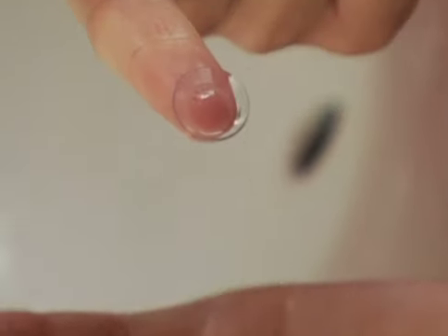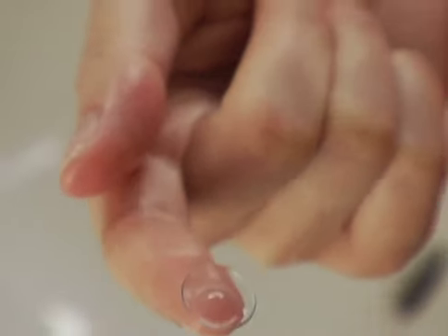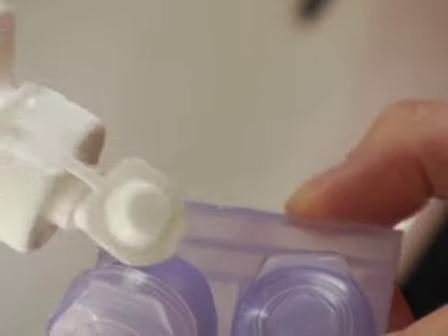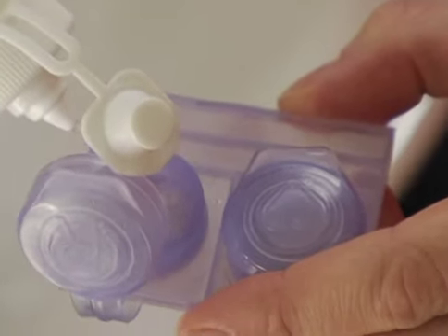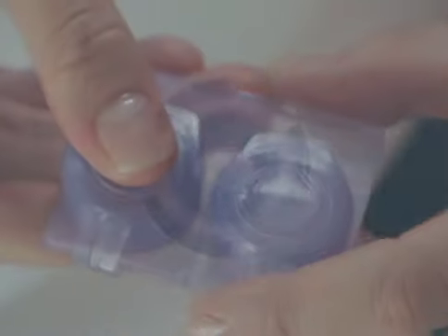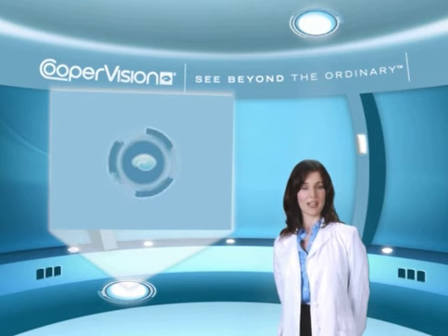Once you've finished cleaning your lens, examine it for any remaining particles. Then place your freshly cleaned lens in a clean contact lens case and fill the case with multi-purpose solution — the solution should completely cover the contact lens. Close the lens case securely and allow the lenses to soak overnight for cleaning, disinfection, protein removal and conditioning.